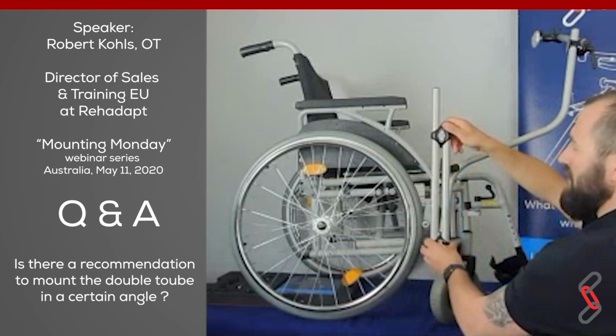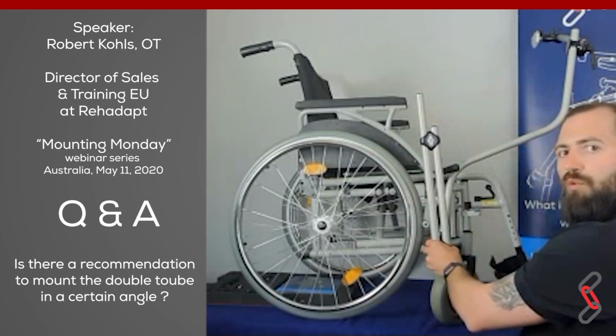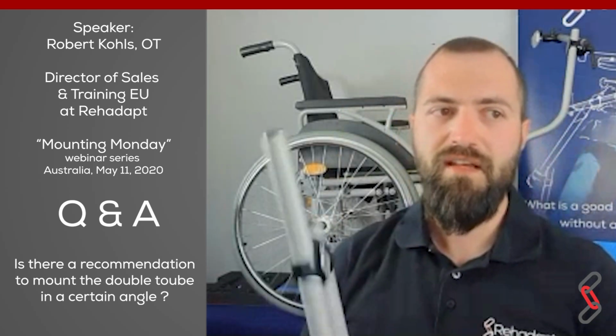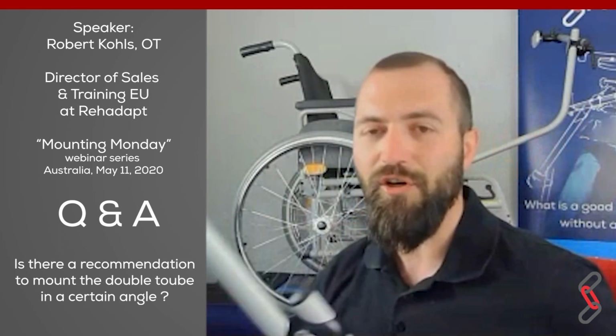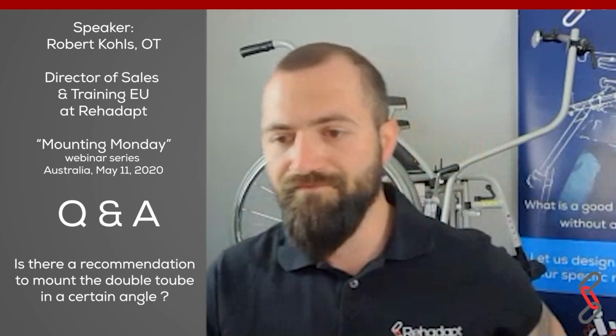But when you install it in that way, for example, you don't have any distance to go forward, and this is something that you need in combination with an eye gaze system. So it is possible to mount it vertically, but for an eye gaze system, most of the time useless, because then you're not getting the right distance between the face and your customer.